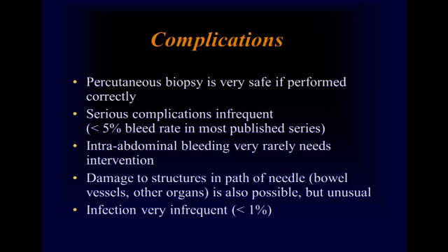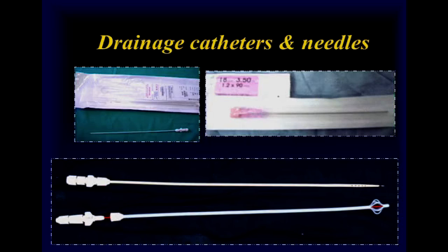By and large, percutaneous biopsies are very safe if performed correctly, and the incidence of serious complications is very rare. Intra-abdominal bleeding is extremely rare, but we have to look out for it. And again, damage to surrounding structures is not common if your technique is proper, and infection is actually not seen in practice at all.